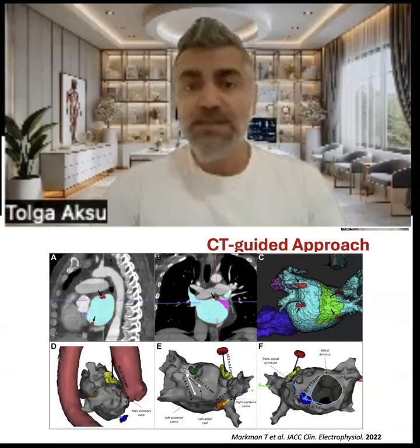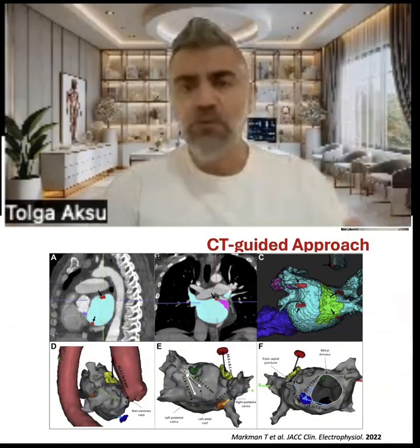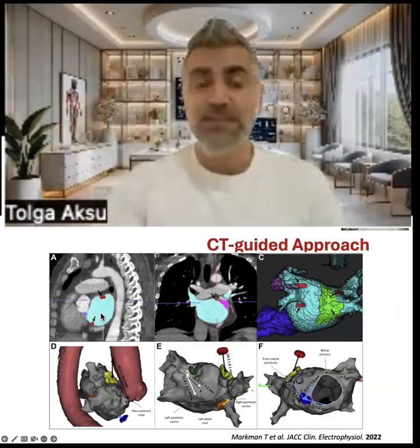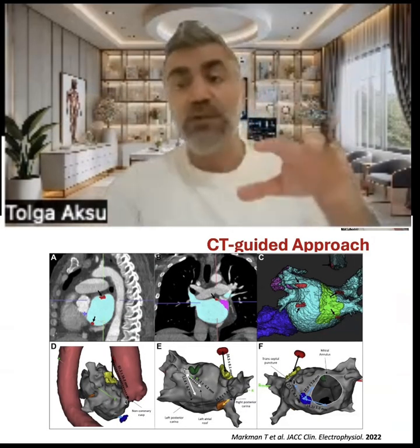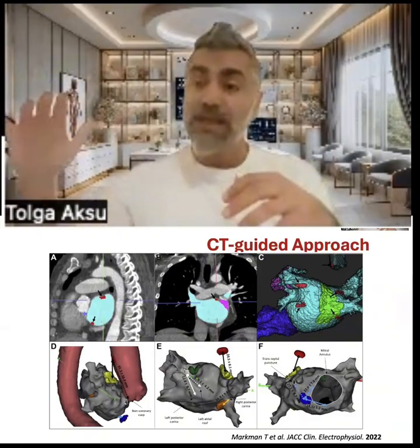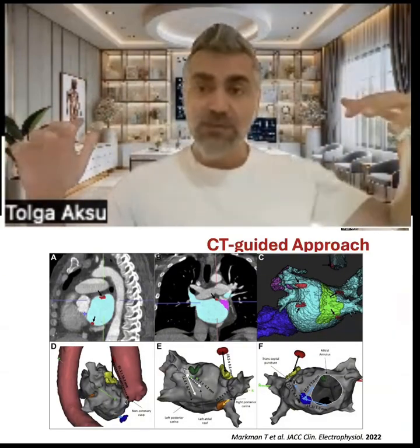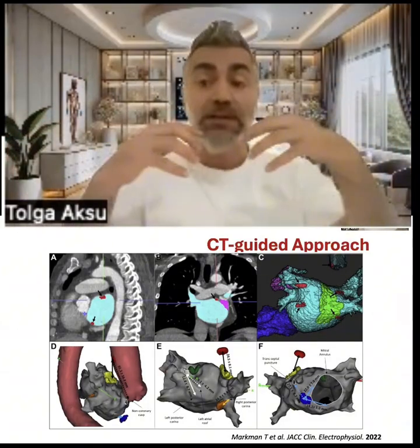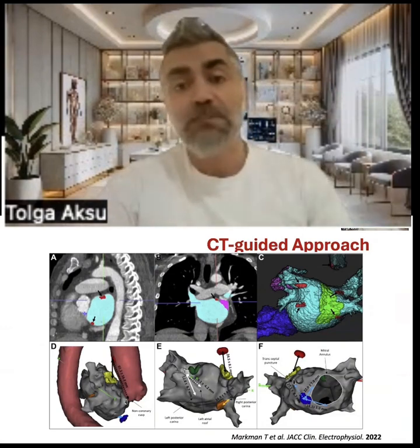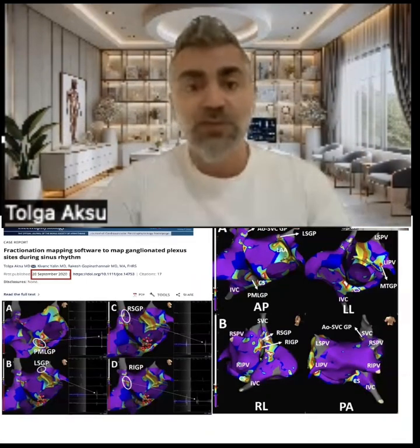Recently, Timothy Markman from USA checked the epicardial fat pad thickness on CT and tried to define whether there is any correlation between epicardial fat pad and fragmented electrograms, and they found a very good correlation between thicker epicardial fat pad area and fragmentation on electrogram.